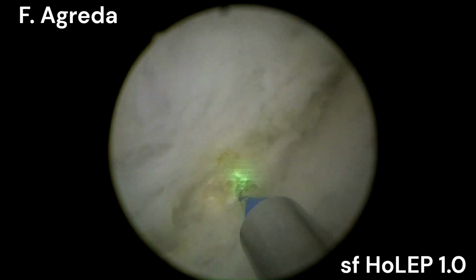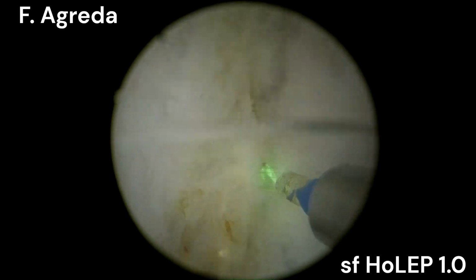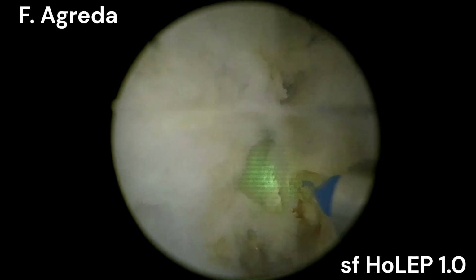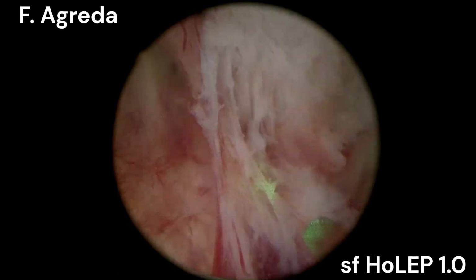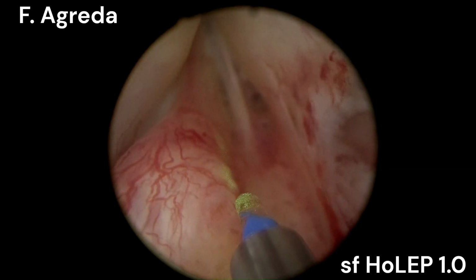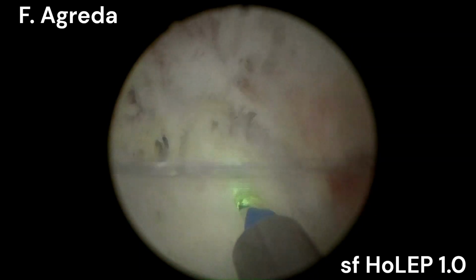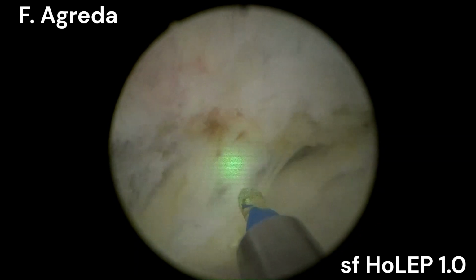Here I'm connecting the two planes, inferior plane of the prostatic lobule, left lobule, and the left capsule. As you can see here, verumontanum is already detached. I'm just doing some more liberation of this left lobe.